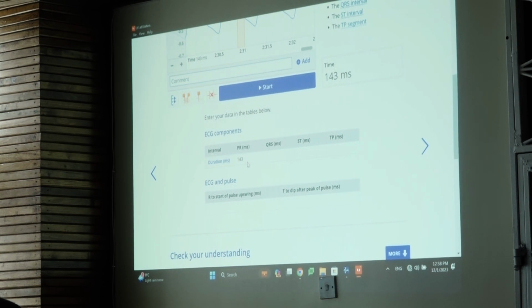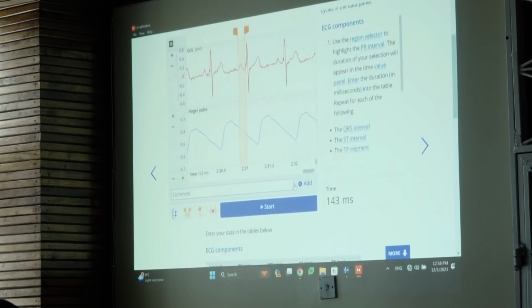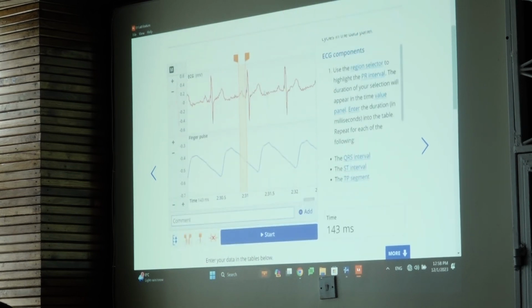Yeah. And then the next thing is maybe we do this measurement because this is, let's say, also an interesting one. We say from when the heart starts beating until, and now we look at the bottom curve of the pulse wave, when the pulse wave here starts, right? So 200, 220, 250 milliseconds is a good standard value as well.